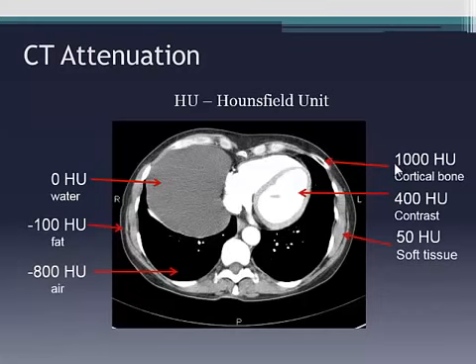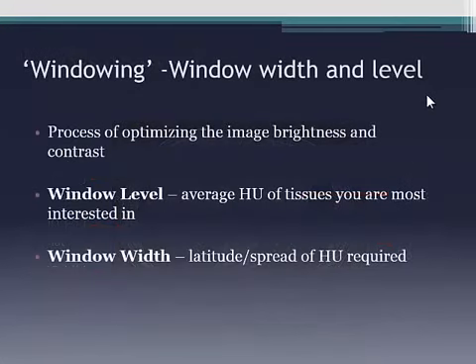In the same way that it's very good at looking at fat, it's also very good at looking at bone. Think about what we do for trauma: we always do a CT, because CT is so sensitive for identifying calcification. So you can use that to your advantage. For example, when you're looking at pericardial disease, you often do a CT and an MRI. The point is that with all of these techniques, what we're trying to teach you is a multimodality approach, and what the strengths of each technique are and how they can work in synergy with one another to help you solve clinical problems. Because that's effectively what they are: tools to help you solve a clinical problem.